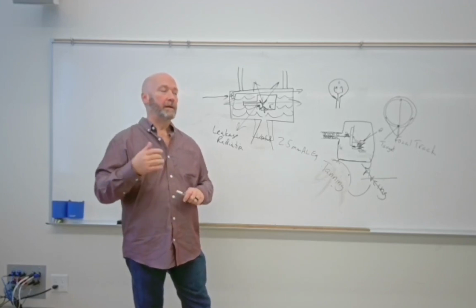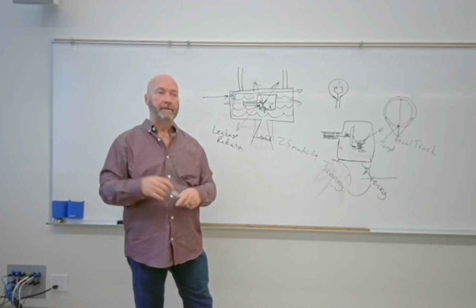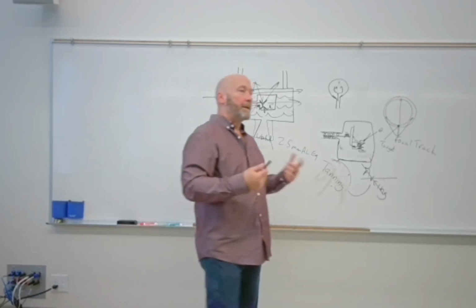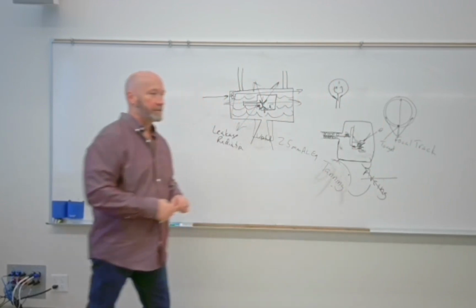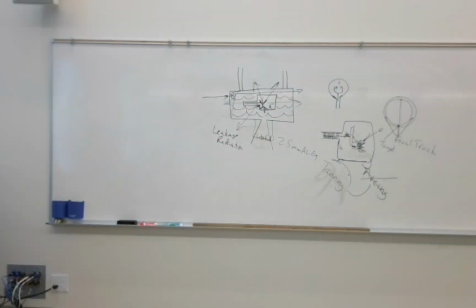Okay, so if we can eject one of those inner shell electrons and replace it with a non-bound electron, we get a high energy characteristic X-ray photon, right? So tungsten, we're going to use it for its atomic number essentially for those two reasons, but we're also going to use it because it takes a lot to melt it and it conducts heat quite well.